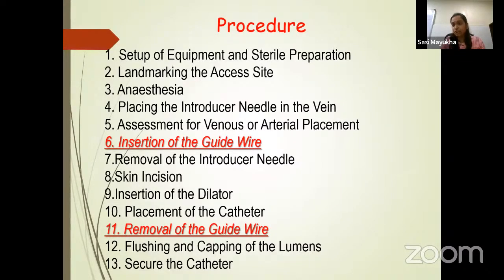After placing the catheter, you have to be very careful to remove the guide wire. After which, you have to flush and cap the lumens and secure the catheter.